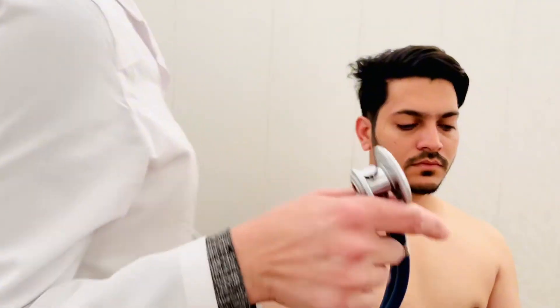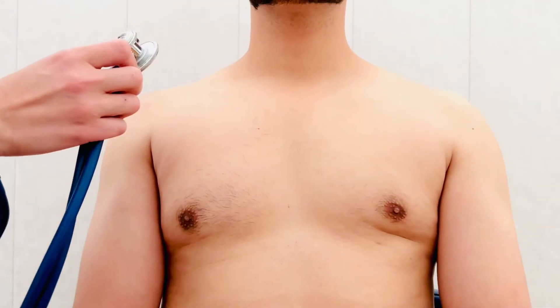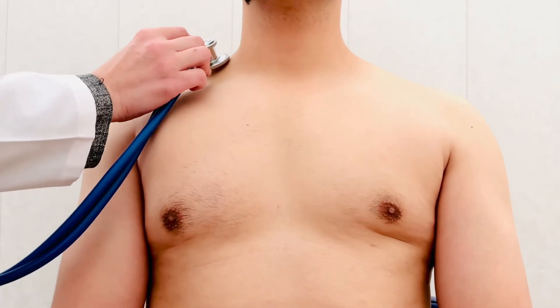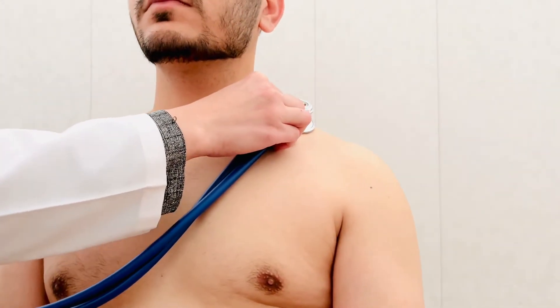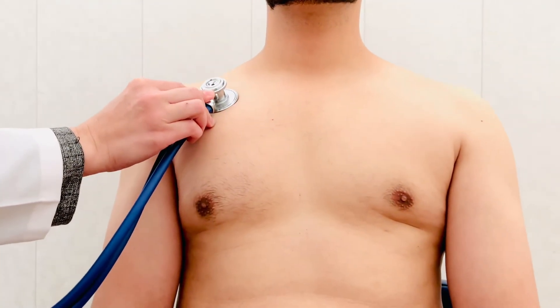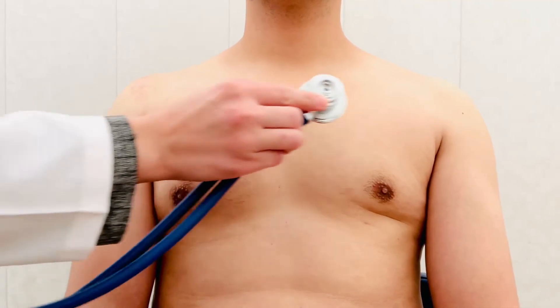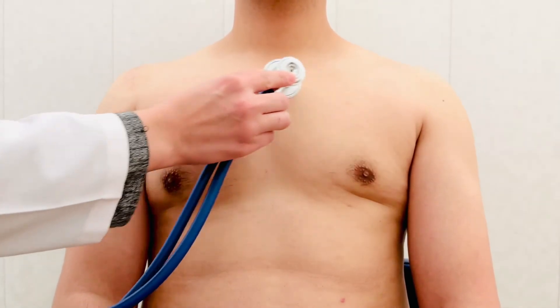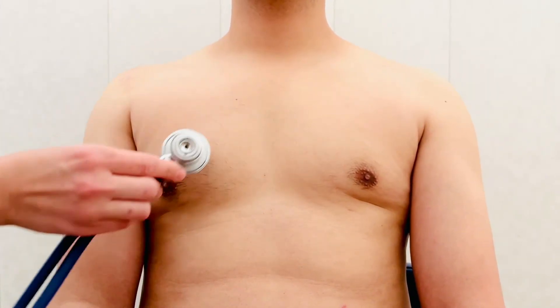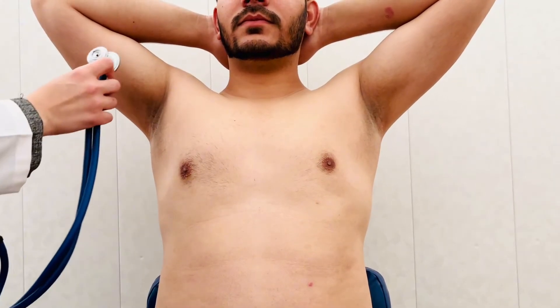Let me show you the auscultation points for vesicular sound. The listening points are the supraclavicular region on both sides, the infraclavicular region on both sides, and the intercostal spaces. Pay attention that on the left side, above the heart region, we do not listen for sounds because of the heart.